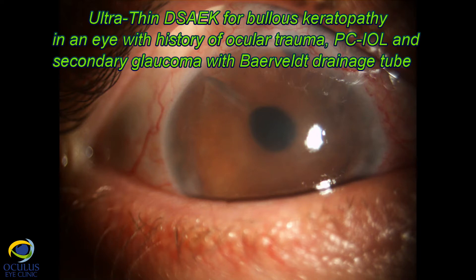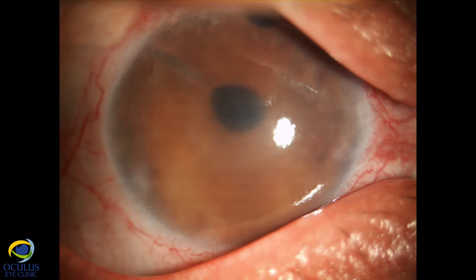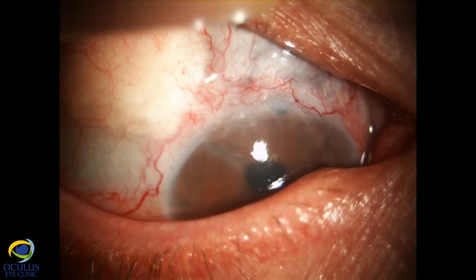This is a young patient with a history of eye trauma followed by cataract surgery and multiple glaucoma surgery procedures, including a Baerveldt drainage tube, who developed bullous keratopathy and was seeking corneal transplant surgery.